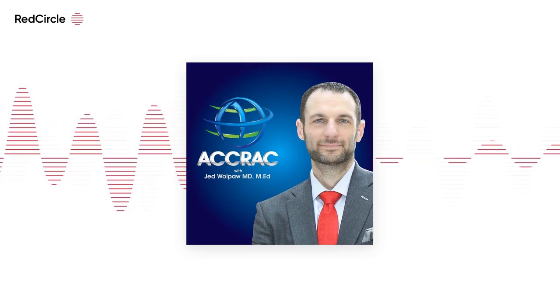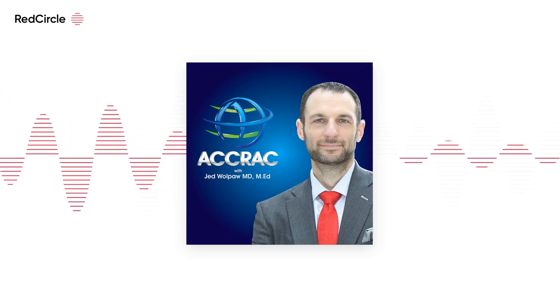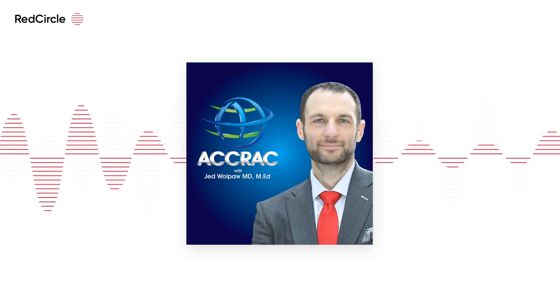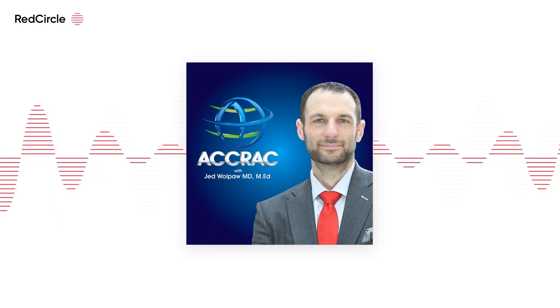Essentially, it shows you distribution of ventilation and it calculates regional compliance. And so if you have changes in PEEP, it can measure the changes in regional compliance. One of the things I used to utilize it clinically a lot was just assessing the response to PEEP. So as Brandon mentioned earlier, he'll increase PEEP more quickly, like in increments.